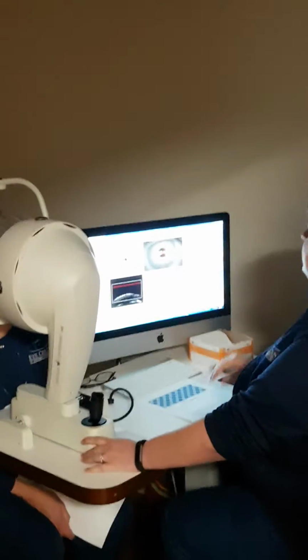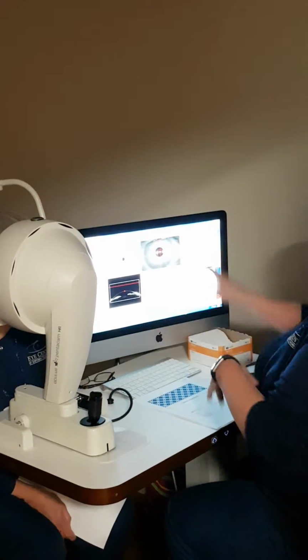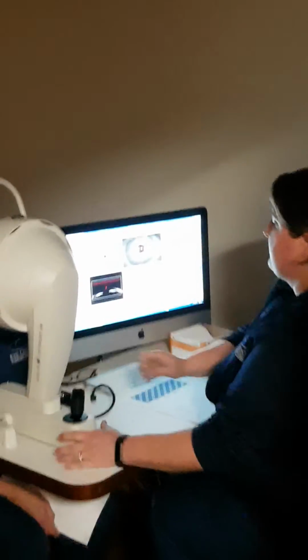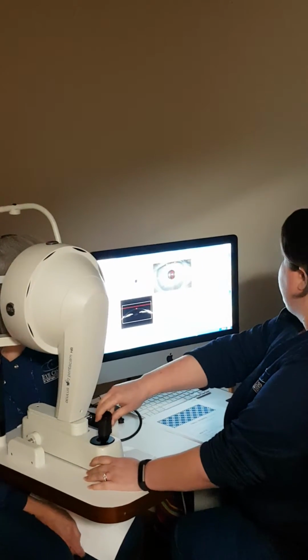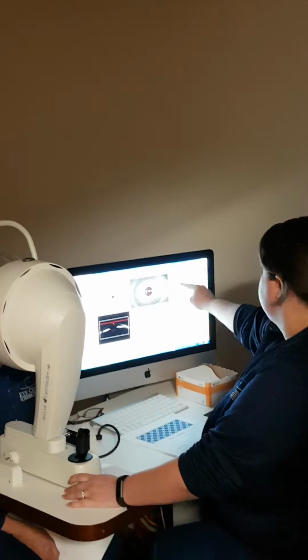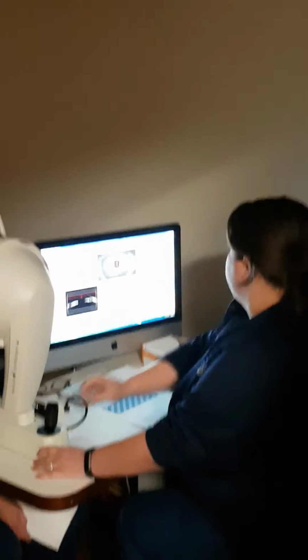And what I normally do is I get it so that I can see the cross section. So it's the bottom left corner. I can see that fairly clearly. I want to go in until it's almost touching, and then I worry about the top right corner and getting that centered, okay? So you want the red target to be lined up in the yellow target.